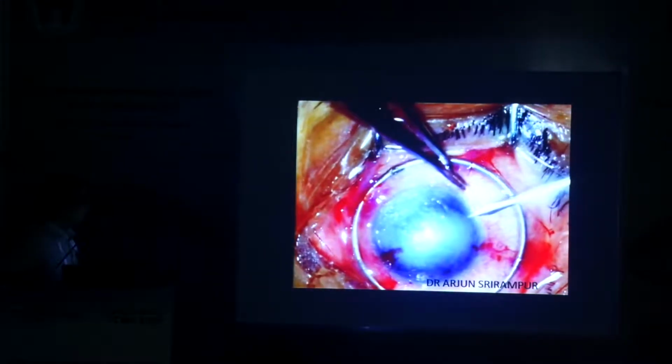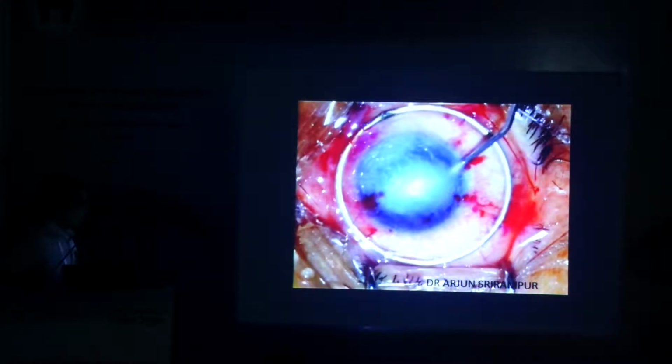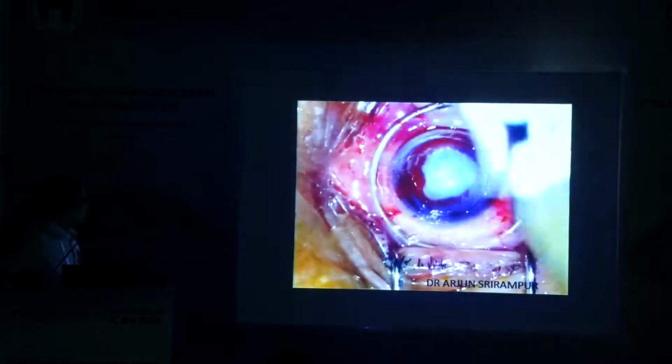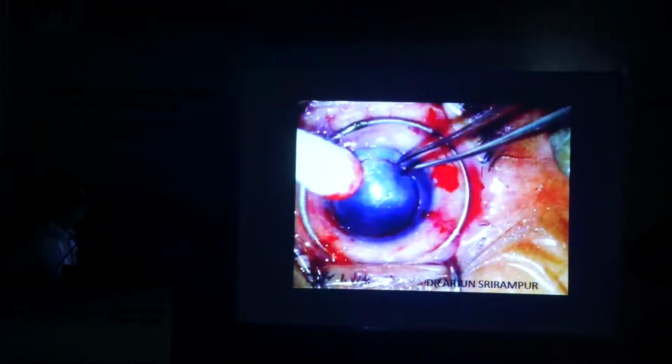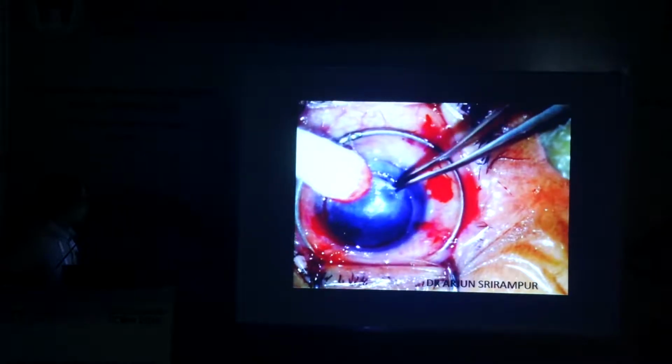A Flieringa ring is put. Anterior chamber is entered with an MVR blade. Viscoelastic is injected into the anterior chamber. Then with the same Hessburg-Barron trephine, which was around 7.5, 0.5 mm lesser than the donor tissue, 400 microns was trephined. Then the same dissection was continued on the host cornea.